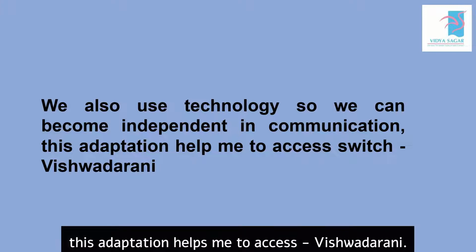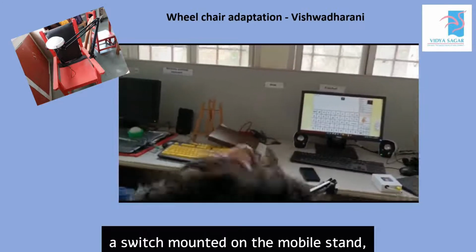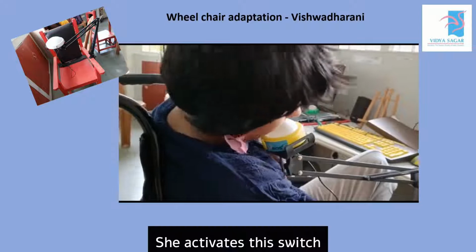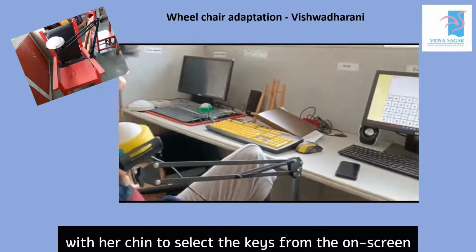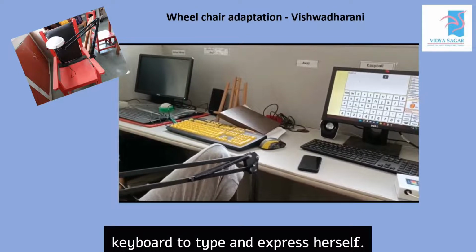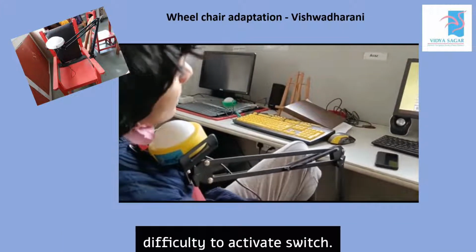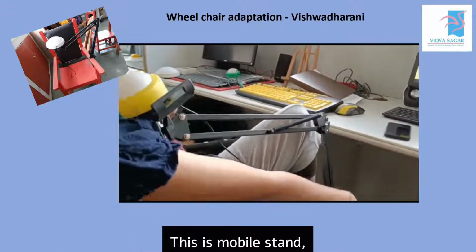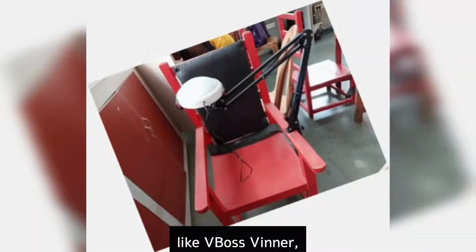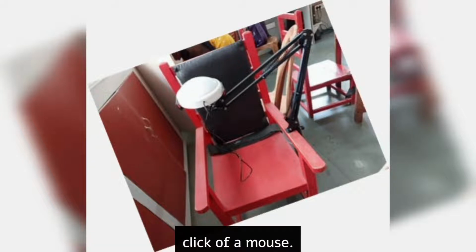This adaptation helps me to access a switch. The person in the video is using a switch mounted on the mobile stand which is fixed on her wheelchair. She activates this switch with her chin to select the keys from the on-screen keyboard to type and express herself. This adaptation helps a person with severe motor difficulty to activate a switch. This is a mobile stand which can be used to place any switch like VBOS Winner, Bluetooth Aditi or any device which acts as a left click of a mouse.